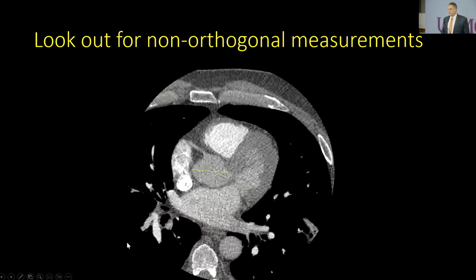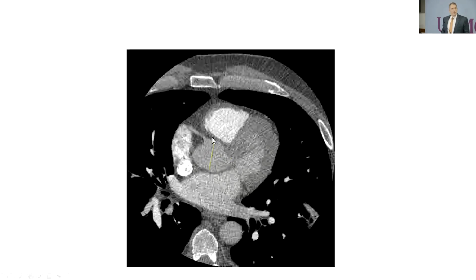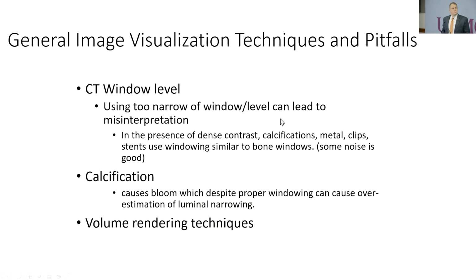And in this case, I put a marker here. It's a little hard to see, but sometimes radiologists will make measurements across here, measuring the largest dimension. That's really inaccurate. Here I depicted measuring across here. Generally, when you're looking at a large number of CT scans over time, there are some things you can do to get a gestalt of what the changes are, but in terms of actually reporting and making clinical decisions, we try to make those off the orthogonal images.